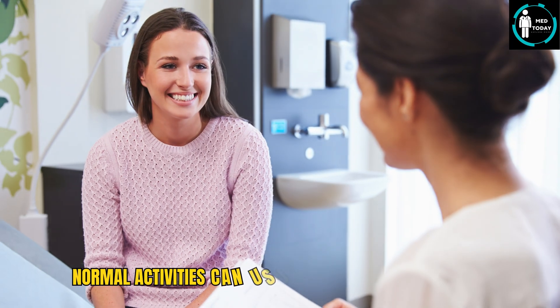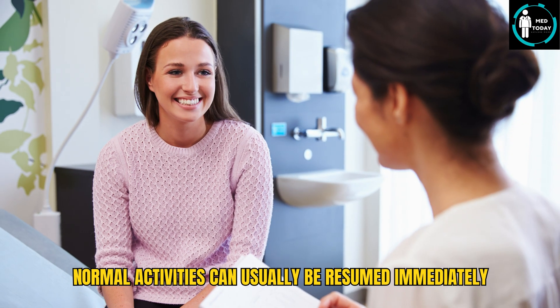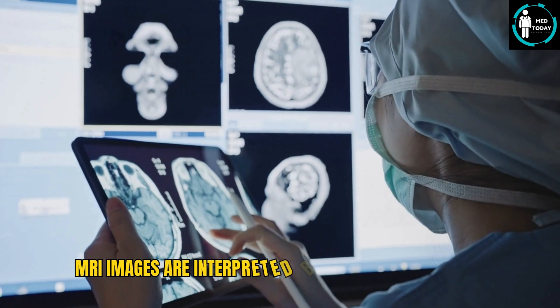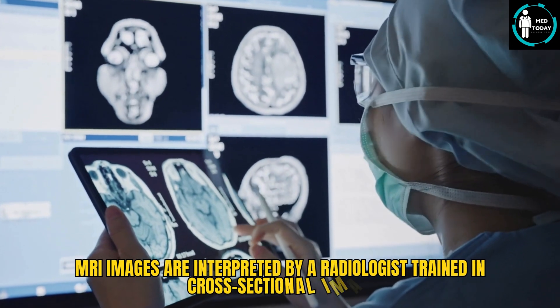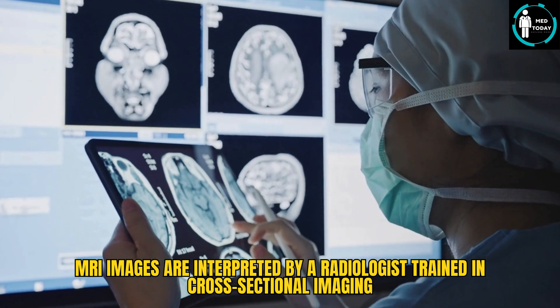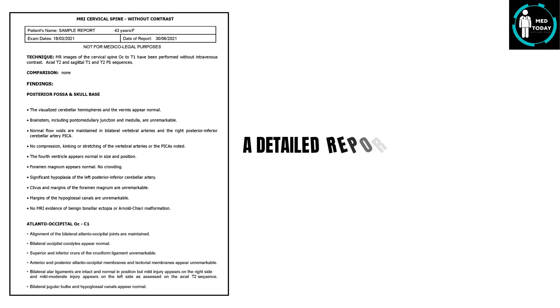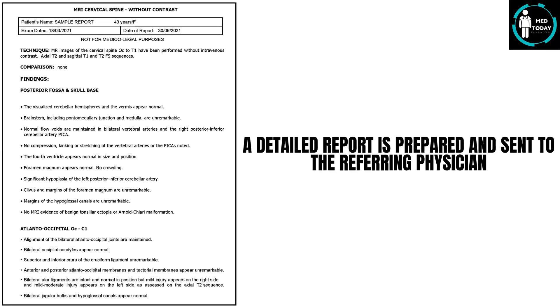Normal activities can usually be resumed immediately. MRI images are interpreted by a radiologist trained in cross-sectional imaging, and a detailed report is prepared and sent to the referring physician.